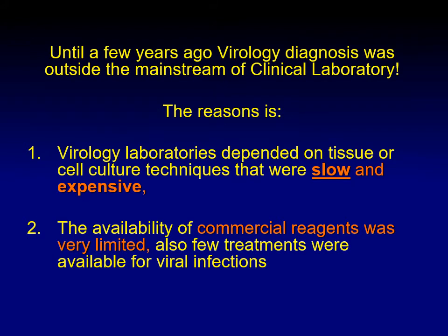So until a few years back, virology diagnosis was outside the mainstream of clinical laboratories. And the reason why is mainly because the virology laboratories a few years back depended on some simple methodologies to detect, such as tissue culture techniques. Those techniques were really slow and expensive. The availability of the commercial reagents was very limited, and also few treatments were available during that time.